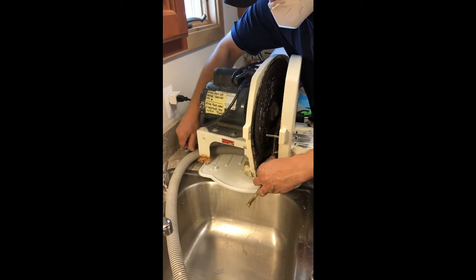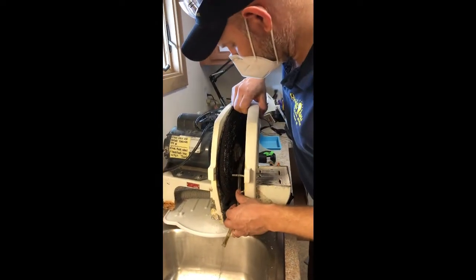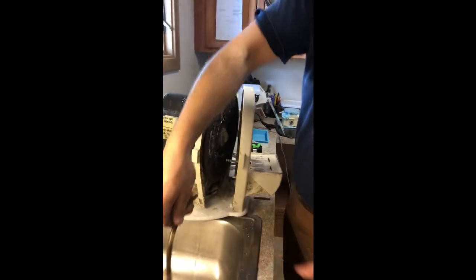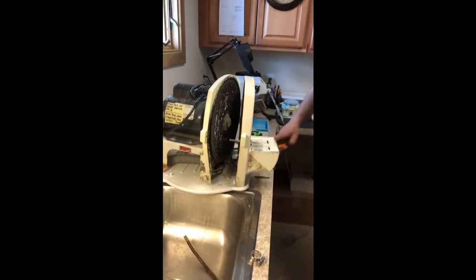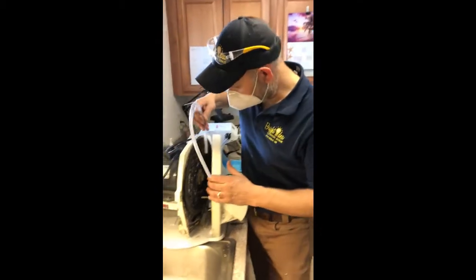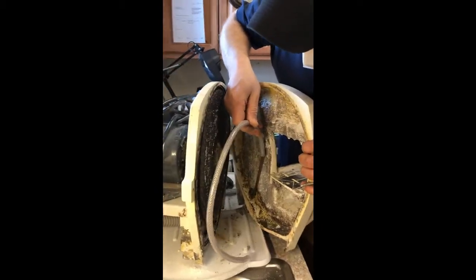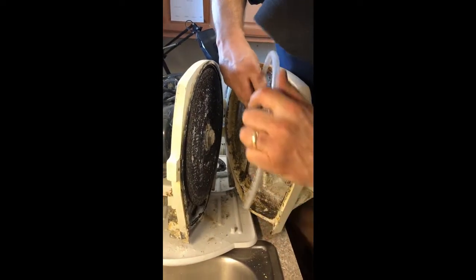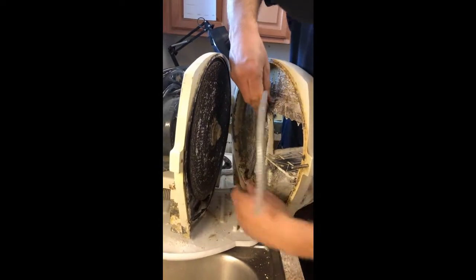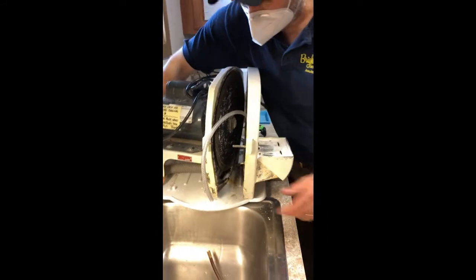All right. And you know what? I think this hose is probably really clogged, which is probably part of the original problem. So let's go ahead and get a new piece of hose. Here's a new piece of hose. We're going to take that new piece of hose and put it right on here. And that should slide down there like so, gently. Okay. Now, with that closed, I'm expecting to see some water come up out of there.